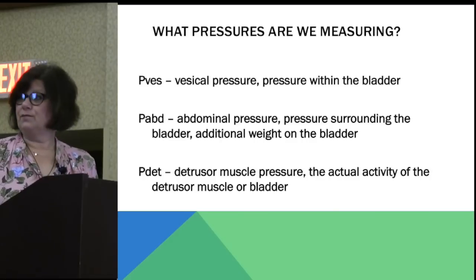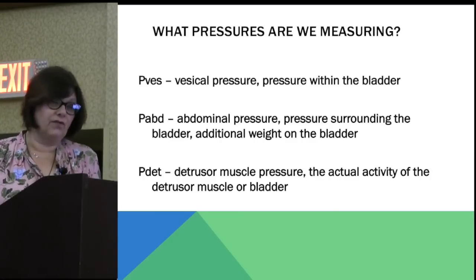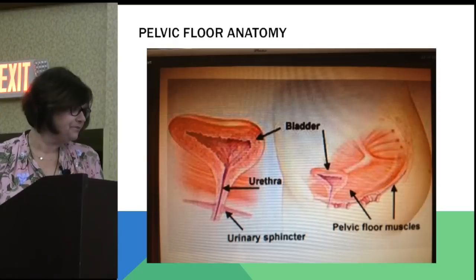And again, the detrusor muscle pressure shows the actual activity of the detrusor muscle, or the bladder. The bladder and the detrusor muscle are basically one and the same.